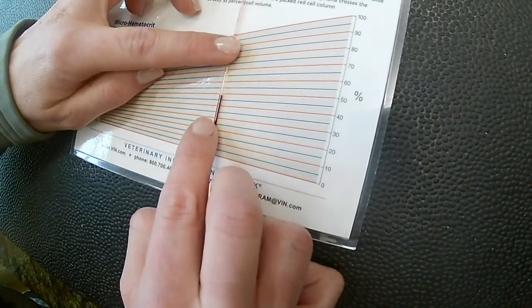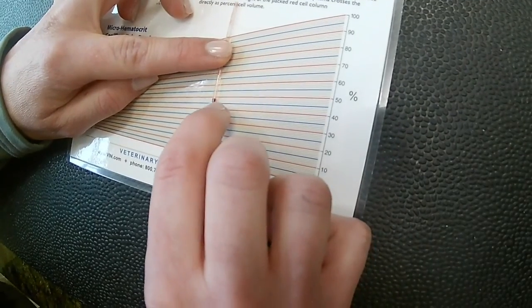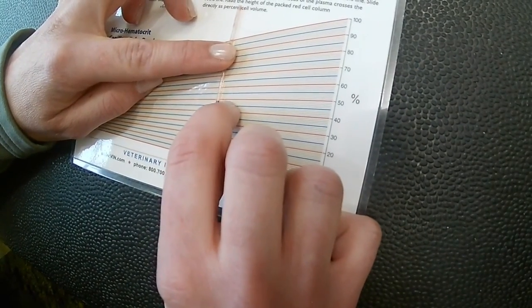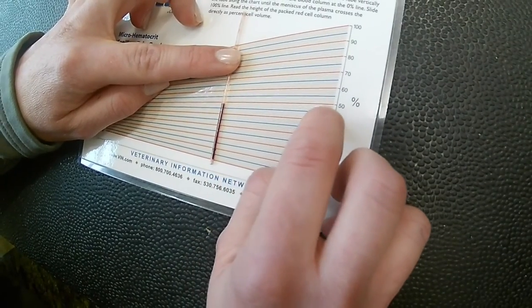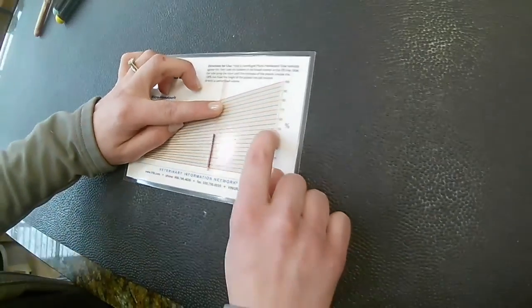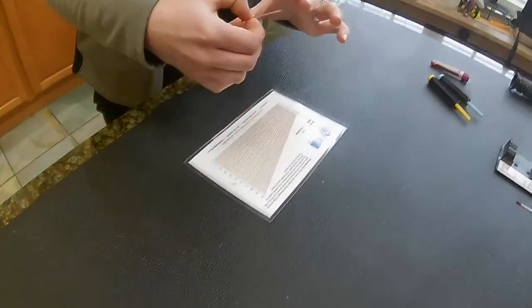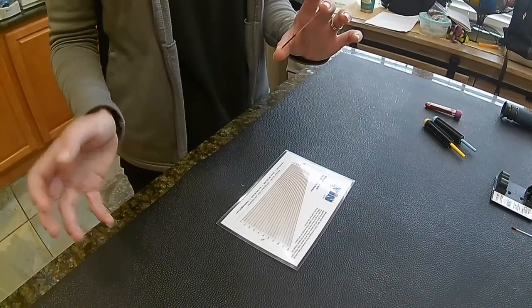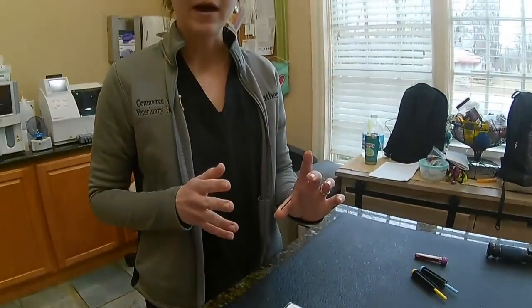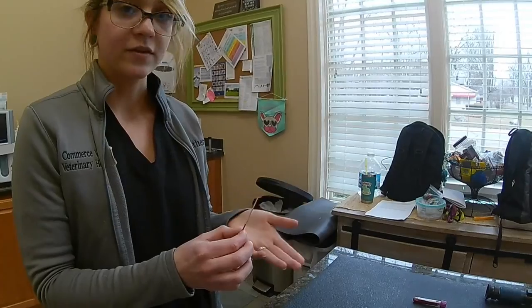So our percentage is going to be kind of along this line. So you can kind of follow it out. These are in increments of 2. So I'm thinking we're right on this line. So we are about 48 is what I would estimate this to be at. Okay, so that's the percentage for the red blood cells. If you wanted to get an average or an approximate amount per microliter, you would take that percentage and divide it by 6. So now what I can do with this is find the total protein.